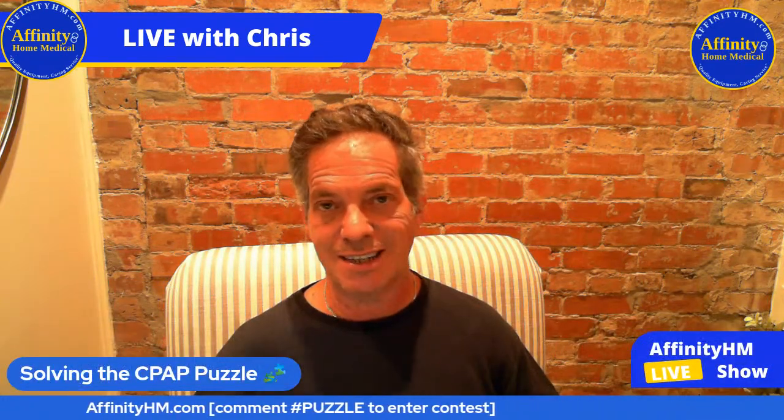All right, let's see. I see some other people are using the F30i, P30i, N30i, and Dream Wisp. Some leak no matter what I do. Favorite is pillows, but headgear always slips off. Yeah, I've heard that for some people. The Knightsbridge is the least likely one to slip off, and here's why.